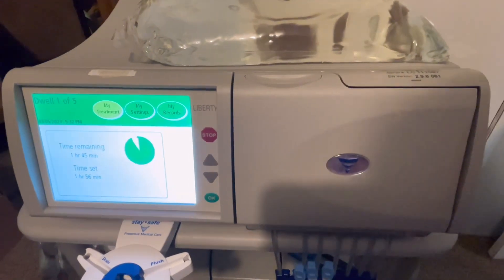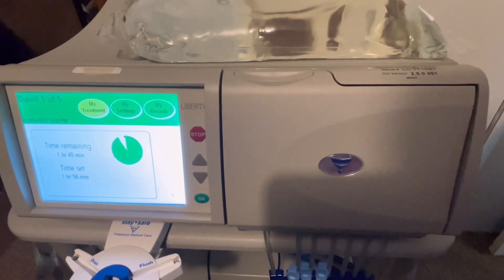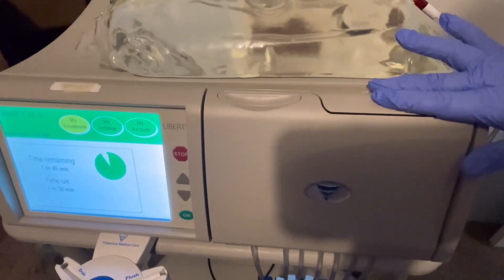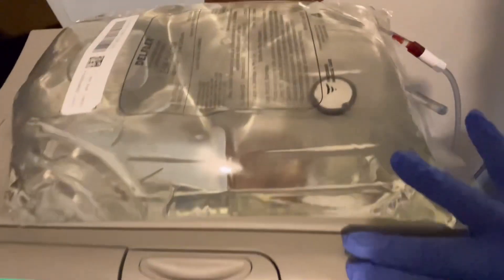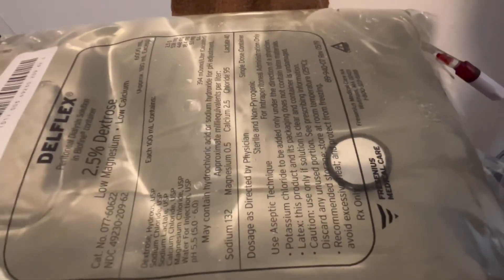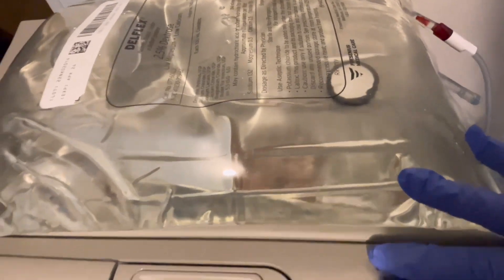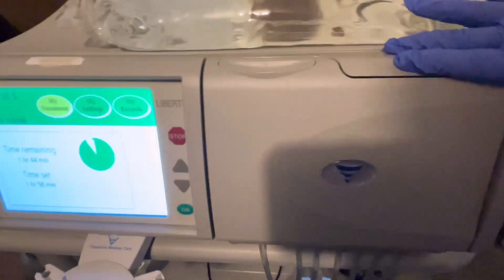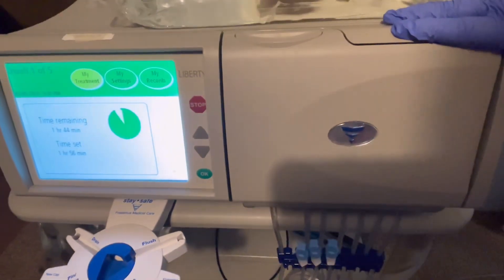This is the peritoneal dialysis machine. Right now we are using a 2.5 dextrose solution — that's the solution they're using to cleanse the blood basically through the peritoneal.